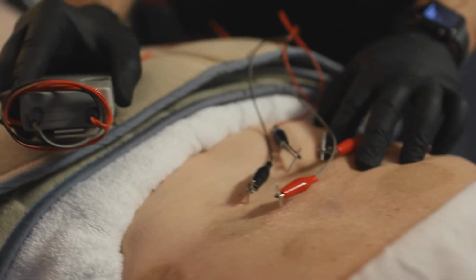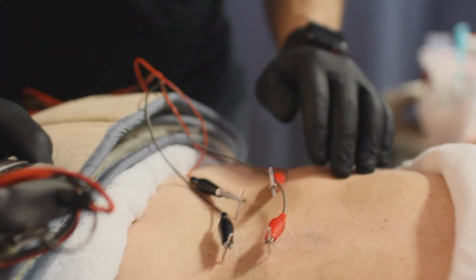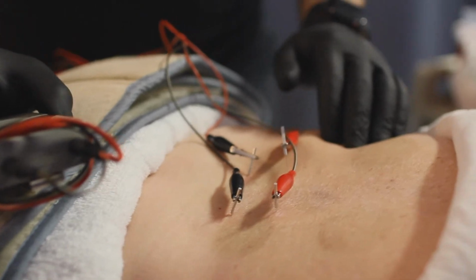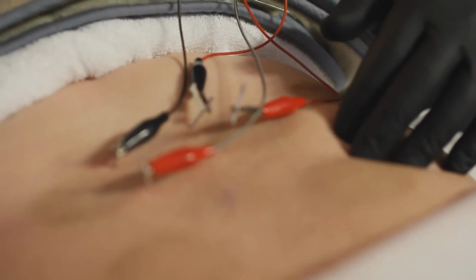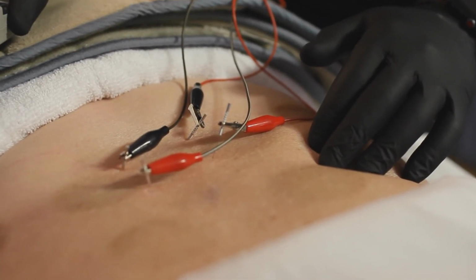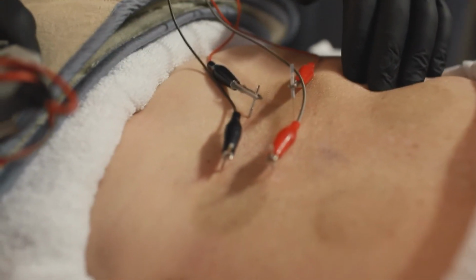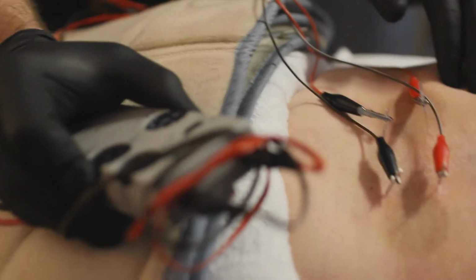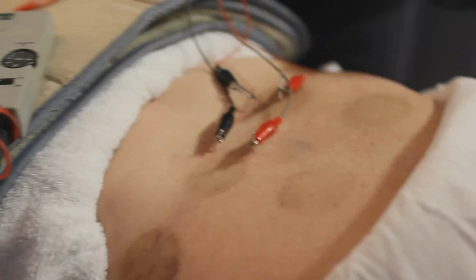And so we're going to provide stimulation, and we have it separated between left and right here. So we're going to get the left side going first. Tell me when, Sonny. Alright, and now the right. Is that good? Alright. And so we'll let this sit anywhere between 5 and 15 minutes, depending on the patient and the situation.